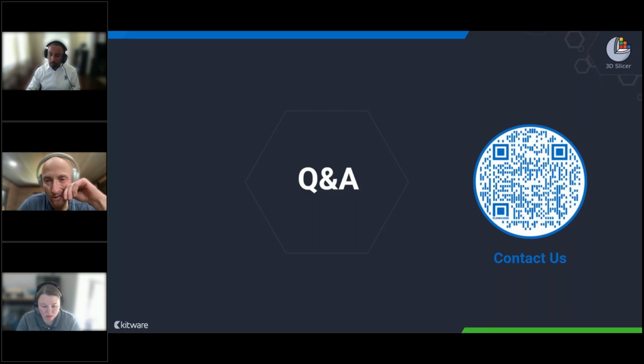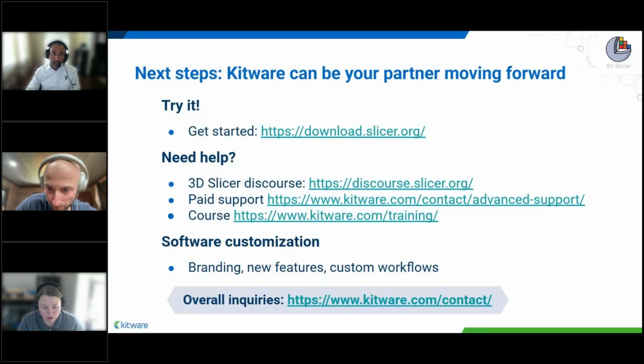So in terms of 3D Slicer training tutorials, there are some tutorials available online, but also in some cases people need a lot more focused tutorial training, and that's one of the things we do at Kitware: we provide private training.